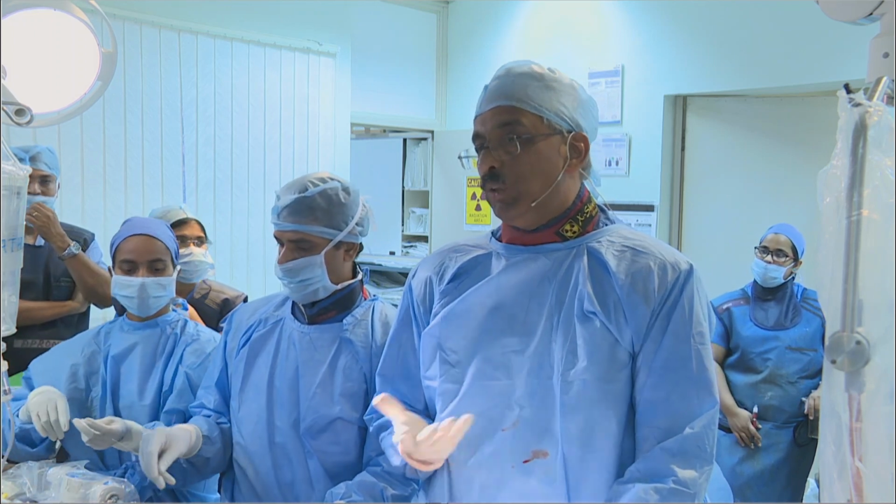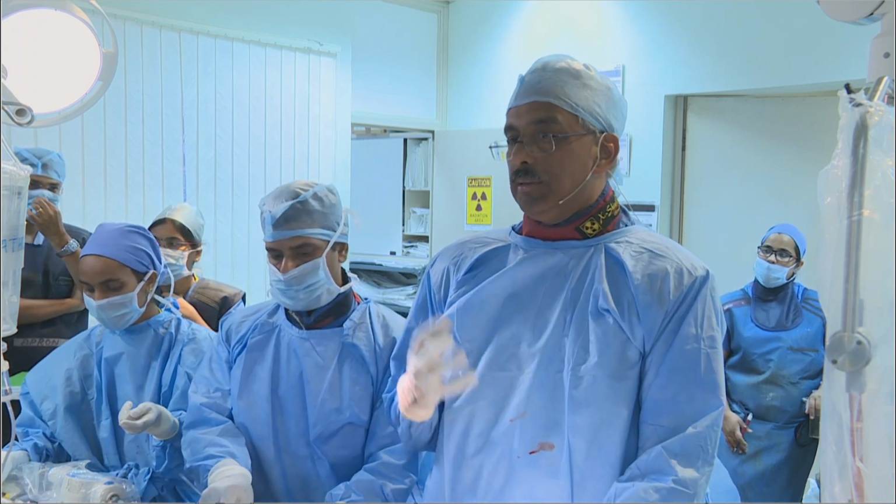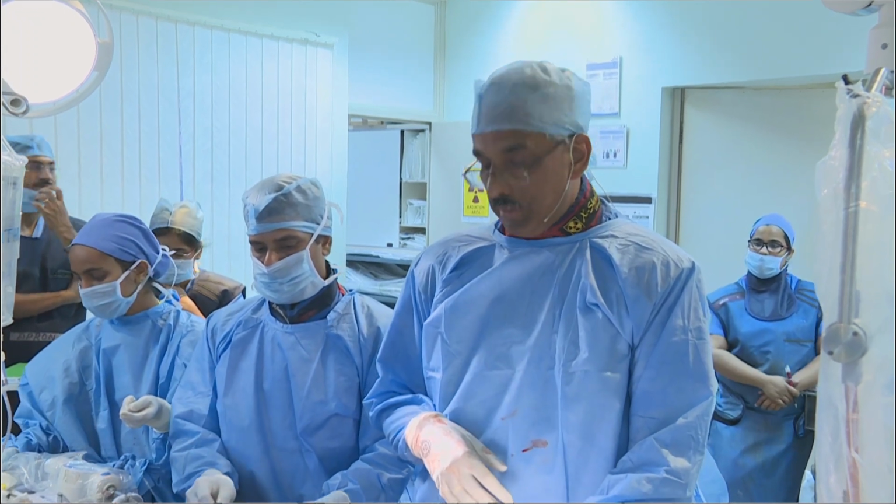If I had that. If you don't have it, well, we still could go ahead, balloon dilate, do an angiosculpt and fix it.